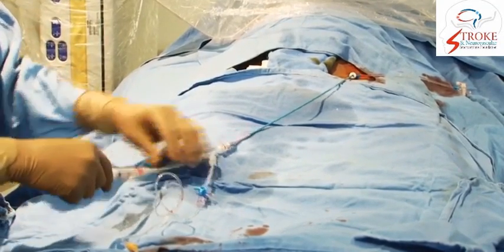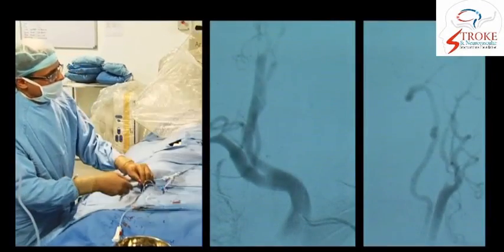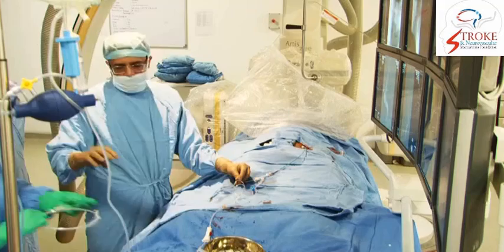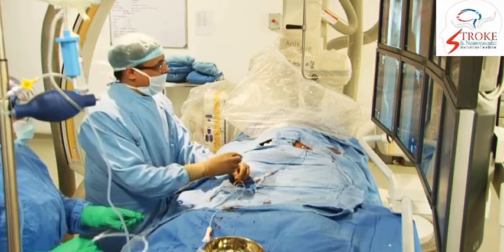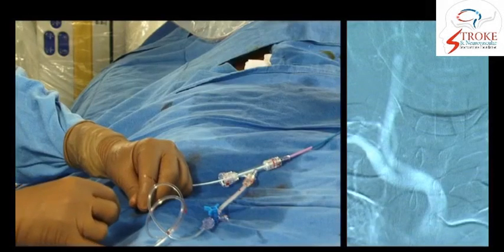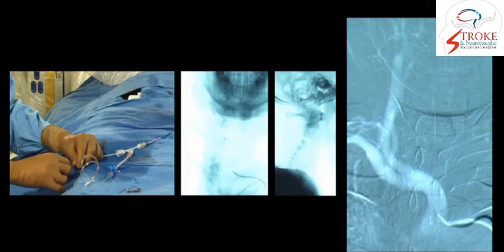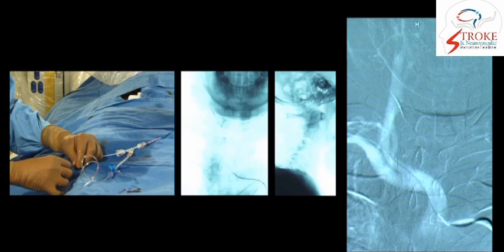So we have taken a road map in both the planes so that we can place the wire under road map guidance into the external carotid artery. The road map helps to do it very safely without disturbing the plaque. So you see, very carefully the wire is being manipulated into the common carotid artery and then into the external carotid artery.